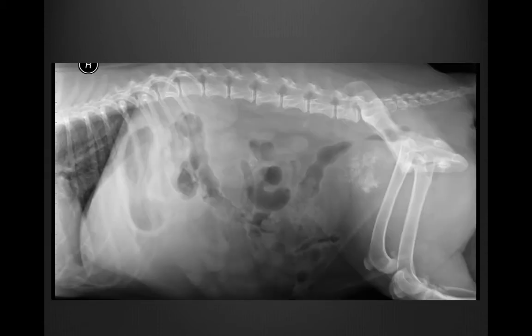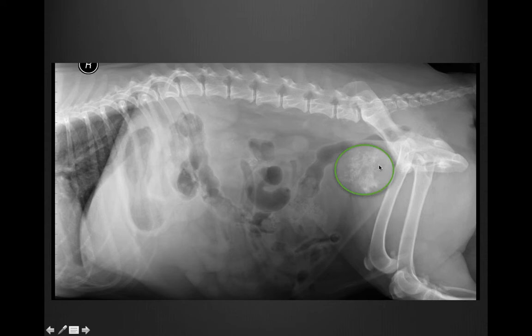We started with two-view radiographs. On this radiograph, we can see that caudal to the urinary bladder — this is the bladder right here — we have this mass with multiple mineral amorphous foci. This mass is also causing compression of the descending colon. In a male dog, when you see a mass caudal to the urinary bladder in this location, the prostate should be the first thing on your mind.